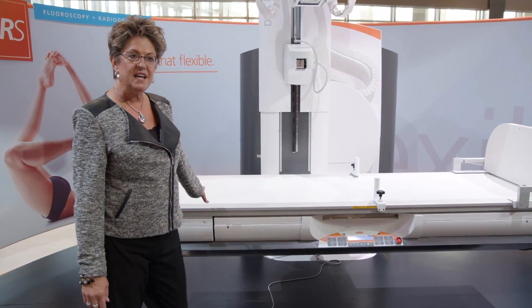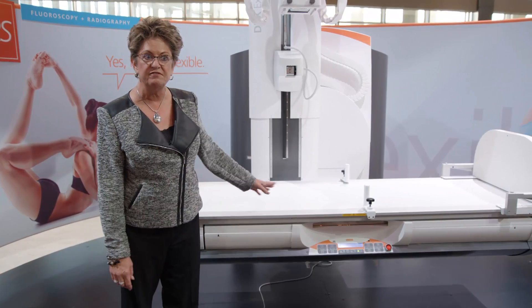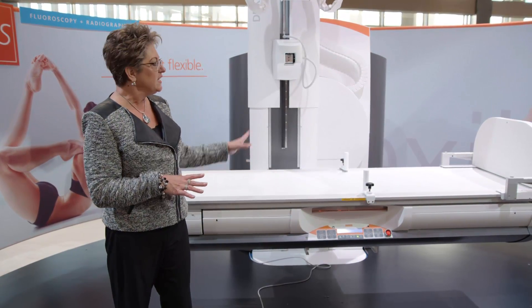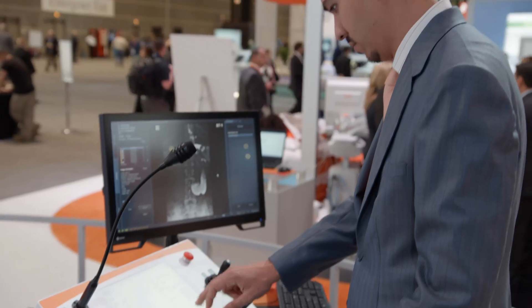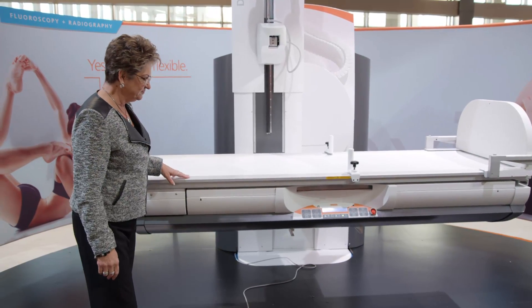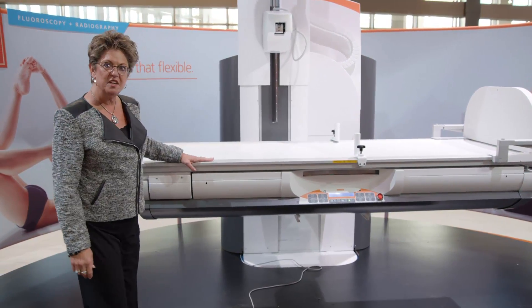The weight limit is 600 pounds, and that's a fully functional system. So we can elevate, four-way float, including standing on the footstand. It also goes to a very high working height.